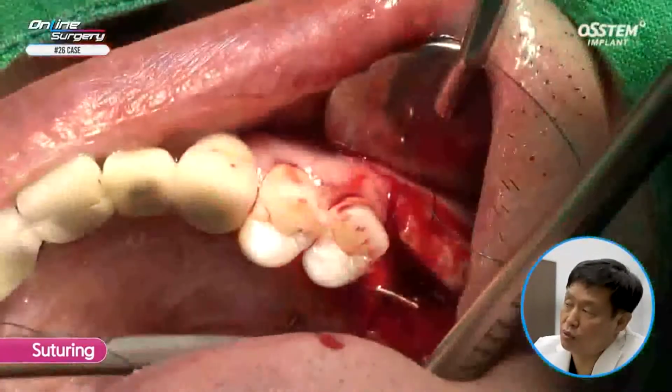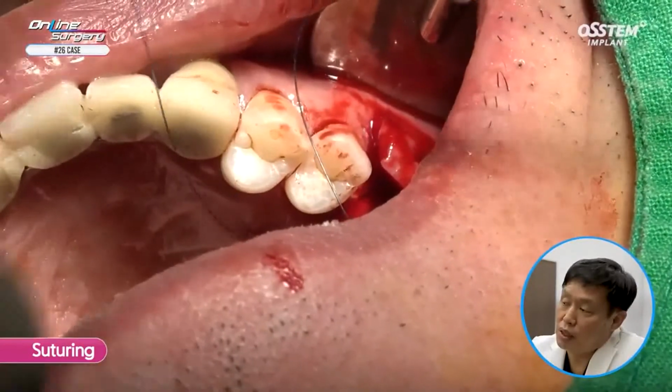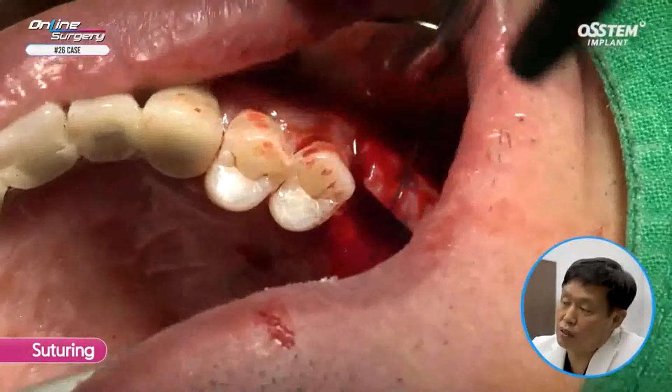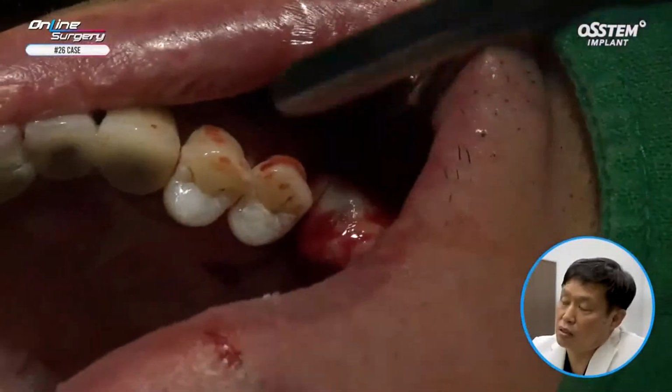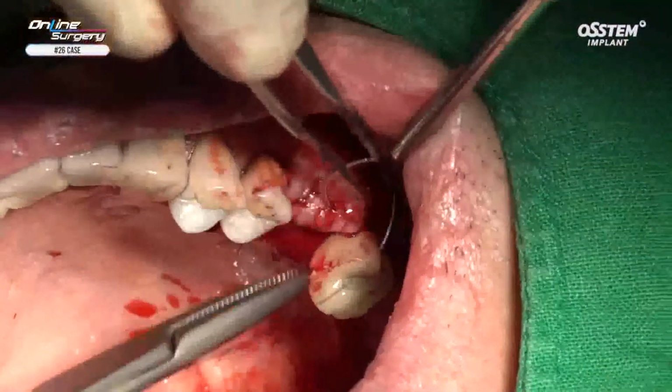Interrupted suture was done. To do suture, I did once on the mesial and distal side, and in the middle I completed using a figure of 8 suture. Suture is being done here.